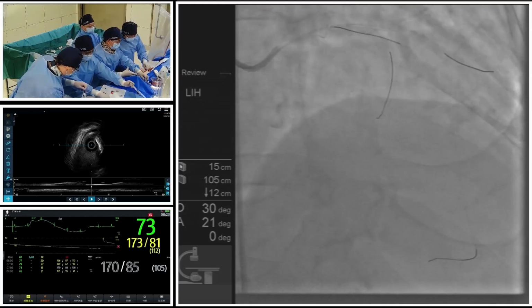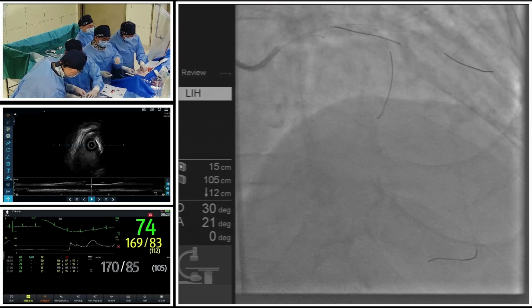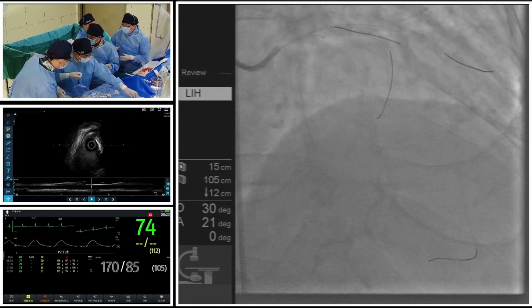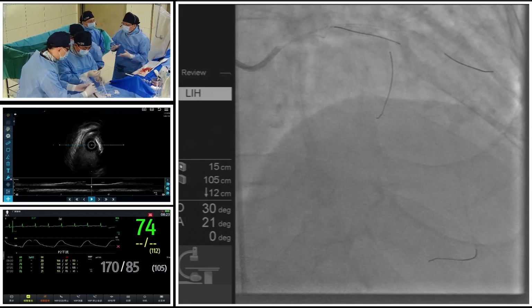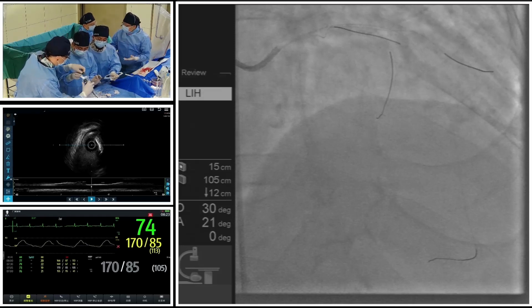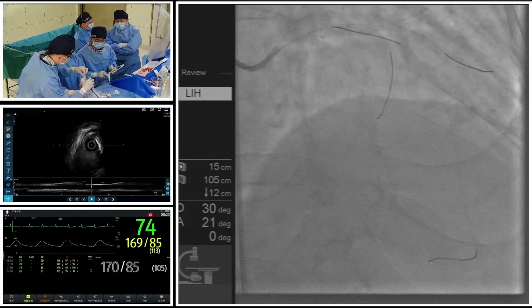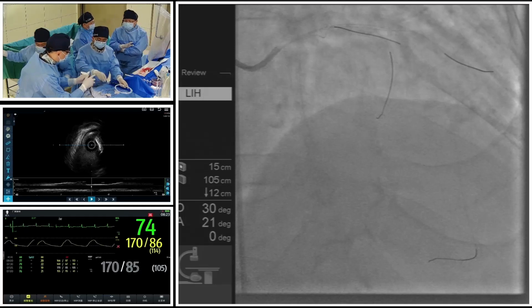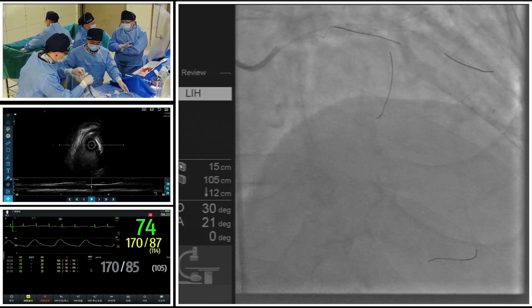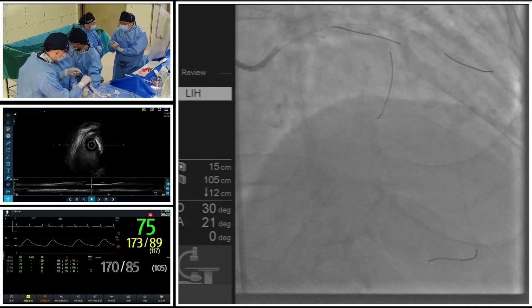So really, the 3D reconstruction system would give us more information because both the IVUS and the OCT couldn't give us a full imaging of the distribution of the calcified lesion in 3D, the relationship between the calcified lesion, soft plaque, and the lumen, and the angle of the side branch.